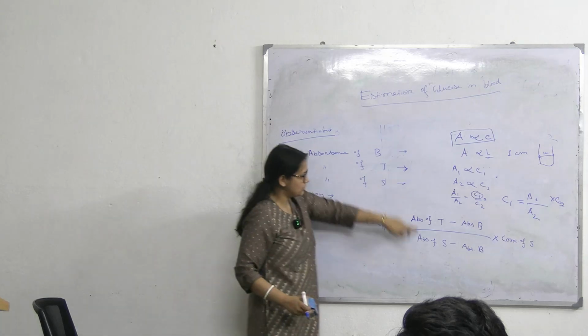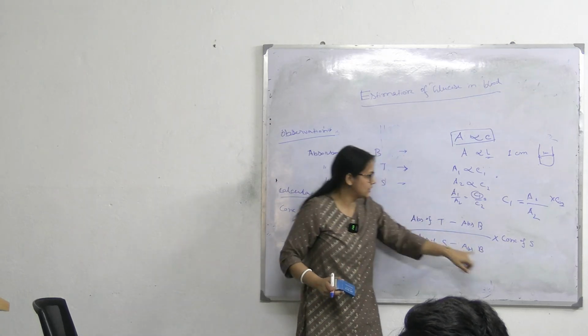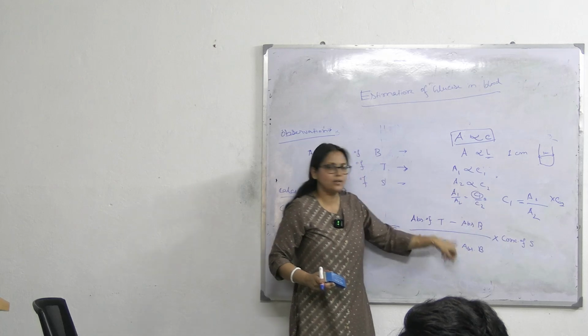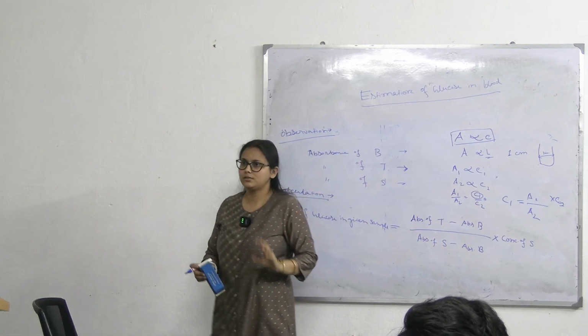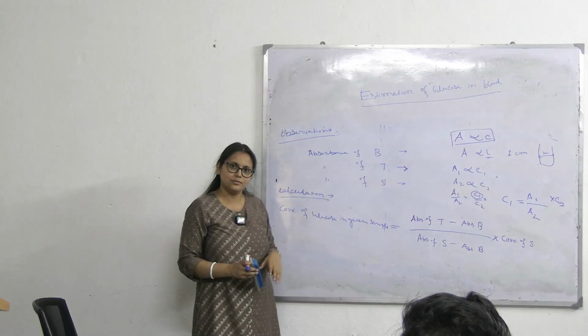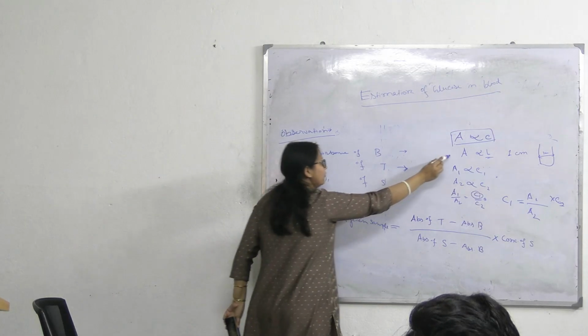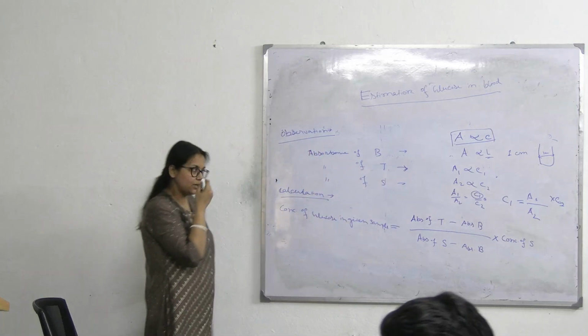বাকি তো সেম, বুঝতে পারছিস তো? বাকি তো এটা A1, A2 আর C2, ঠিক আছে? ব্ল্যাঙ্কটা দুটো ক্ষেত্রেই মাইনাস করছি in case the reagent gives itself a color, ওকে? সো থাকলে ভালো, না হলে -0, ওকে? তাহলে বোঝা গেছে ক্যালকুলেশনটা কোথা থেকে এলো? This is the simplified form of Beer-Lambert law, ওকে?